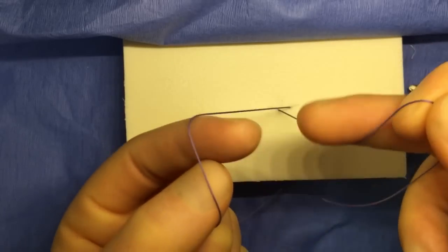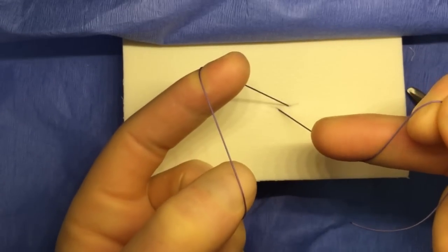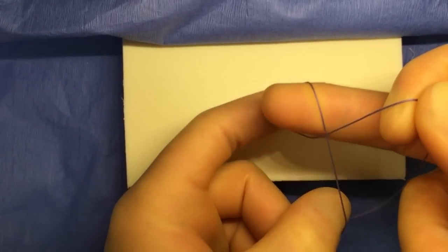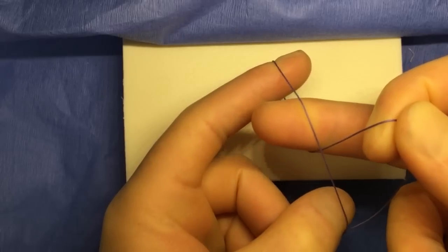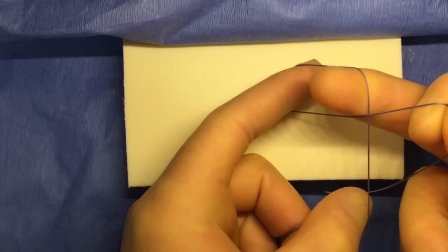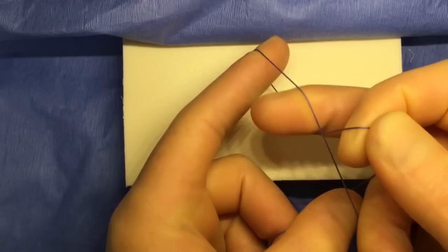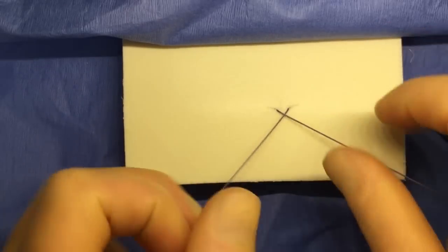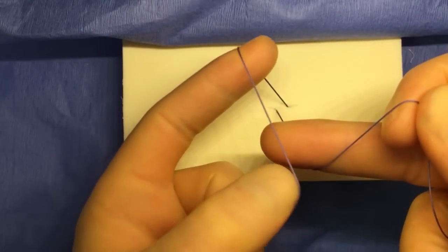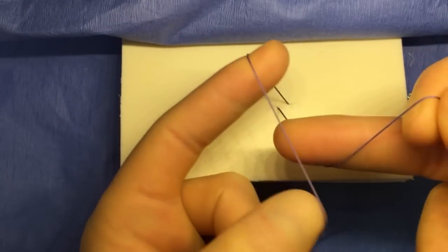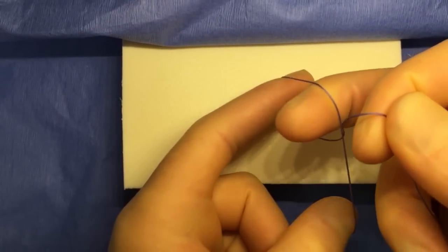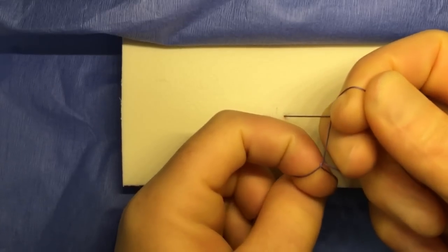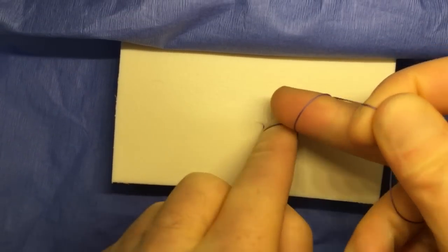Using the same principle, you can do this with one finger in the right hand. Again, the same crossover motion. You'll be using one finger on each hand to throw both knots simultaneously. The right finger comes towards yourself, the left finger goes away. This creates two vertices through which you can rotate.